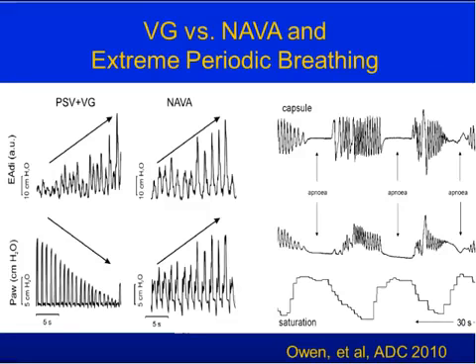It was explained to me that it's kind of like power steering. The driver knows what to do, and we just facilitate what the patient's trying to do. And that's great. But in the case of a premature neonate, I would argue that the driver is blind and drunk. They don't know what they're doing. They have very erratic and unsustained respiratory effort.